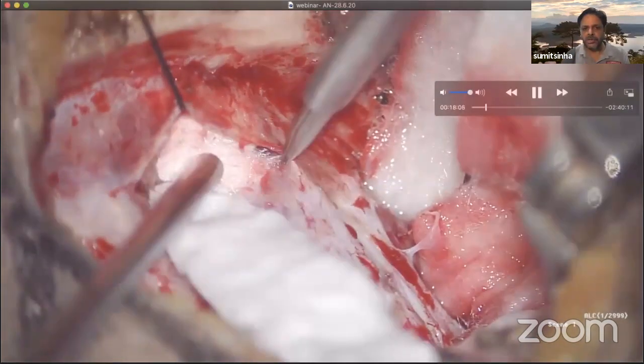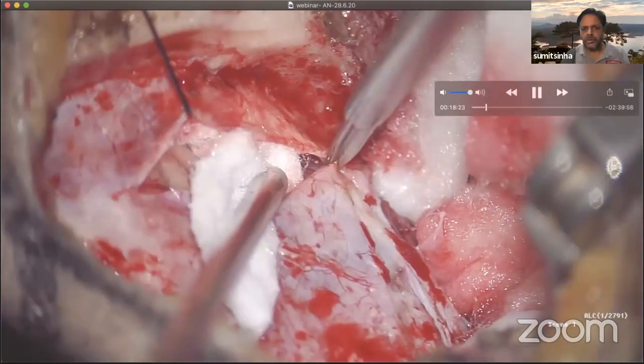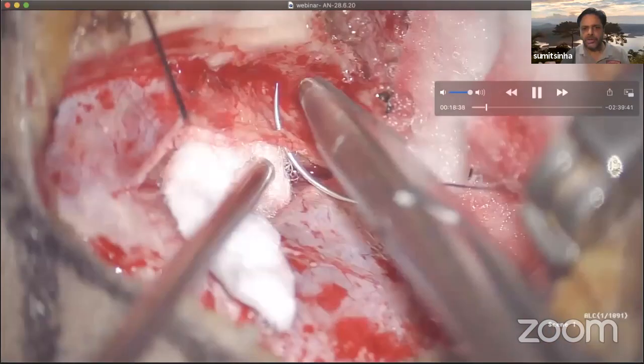And a simple cutting up of the dural flap and taking the hitch sutures on the lateral dural flap.